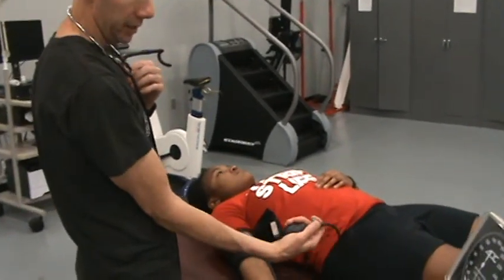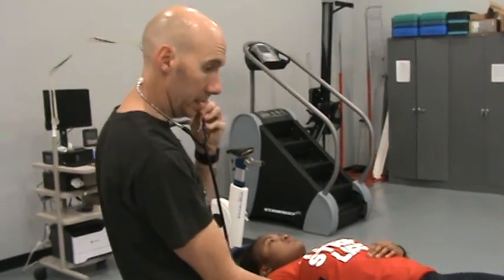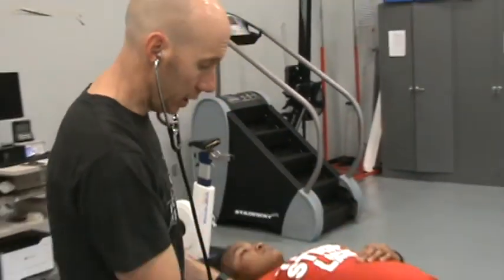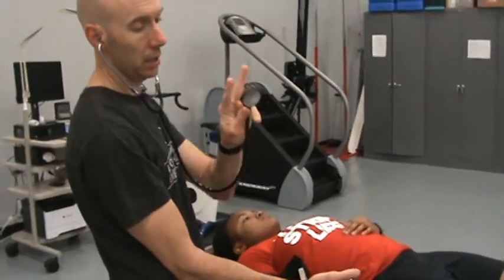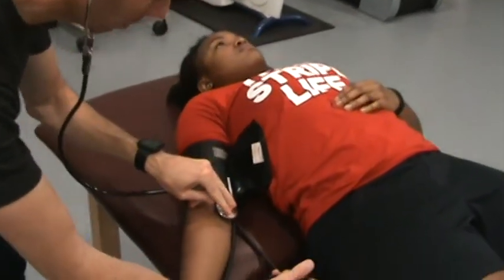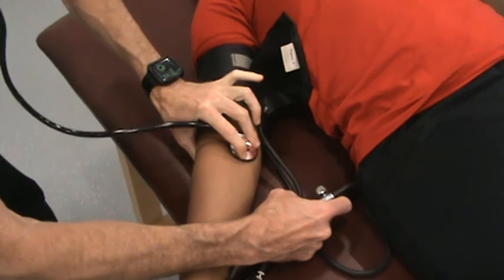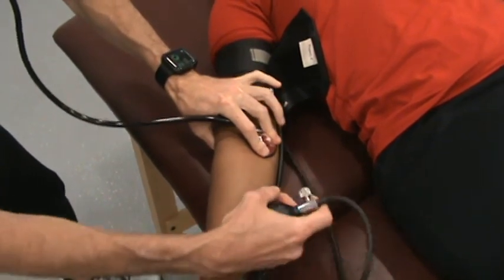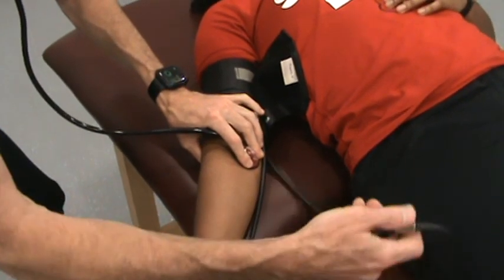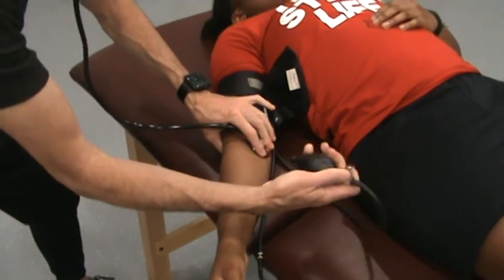Valve in the right hand, index finger and thumb ready to use the valve. I'm going to go ahead and put the stethoscope earpieces in now, using my left hand. I'm then going to use my left middle and index finger, placing the stethoscope directly on the brachial artery, flush against the skin. I'm going to use my thumb to create sort of a clamp to keep that in position. I'm going to keep the tubes away from the stethoscope bell. Once everything is in position, close the valve, pump it up.